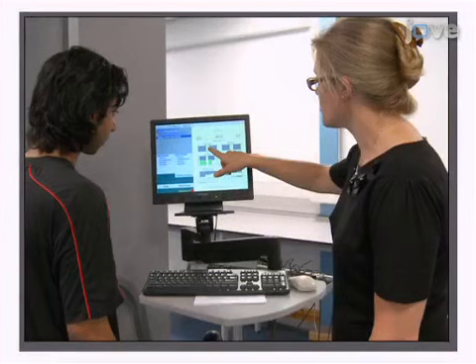Ultimately, computerized dynamic posturography is used to identify possible deficits in the somatosensory, visual, or vestibular systems, and can also determine if a patient has a visual preference by relying on visual information even when it is inaccurate.